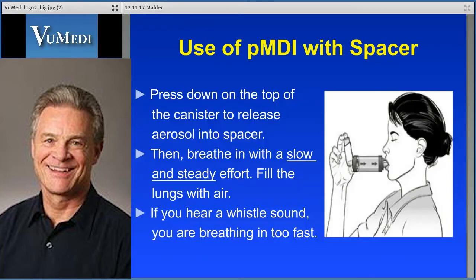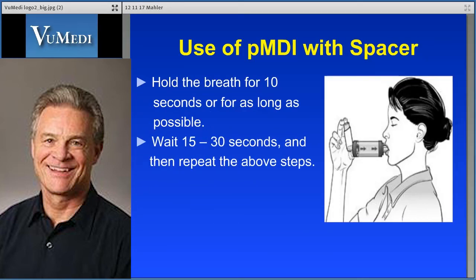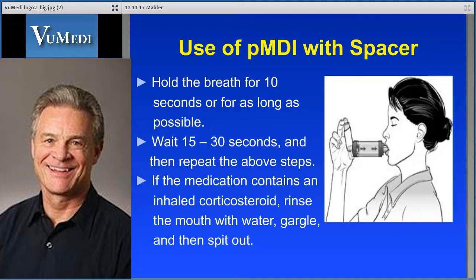If you hear a whistle sound, you are breathing in too fast. Hold the breath for 10 seconds or for as long as possible. Then wait 15 to 30 seconds and repeat the above steps. If the medication contains an inhaled corticosteroid, rinse the mouth with water, gargle, and then spit out.